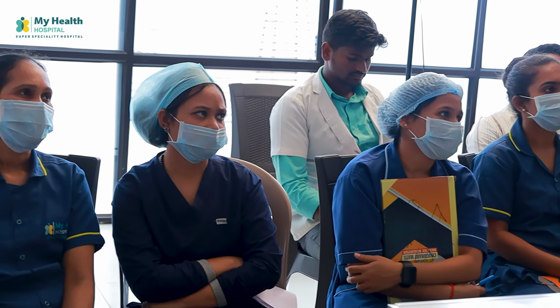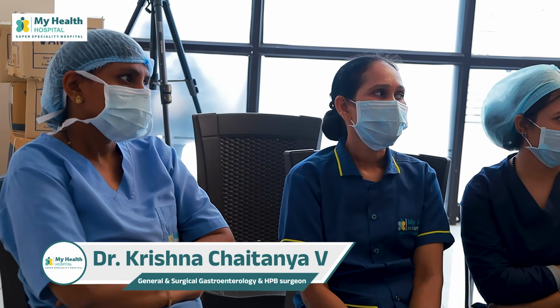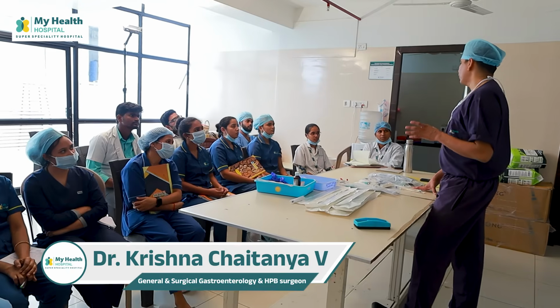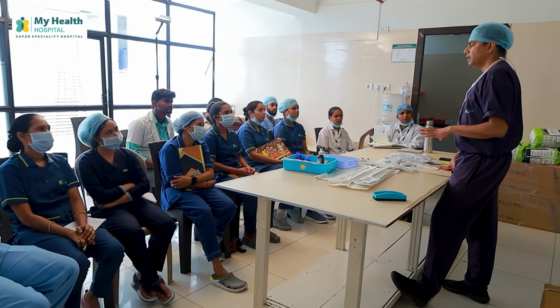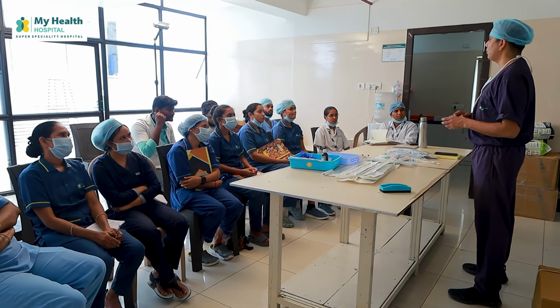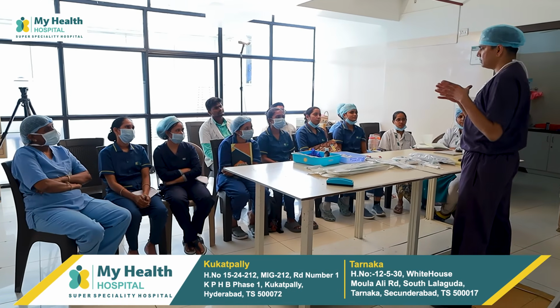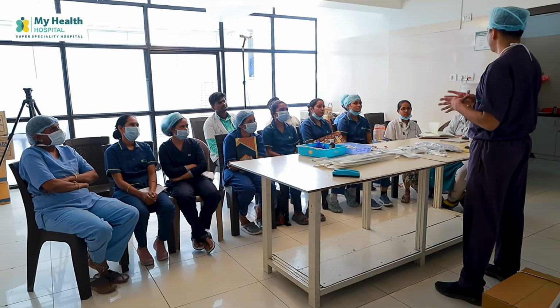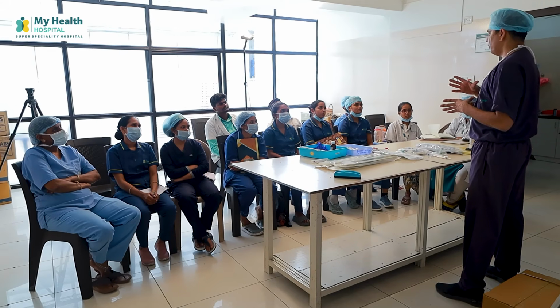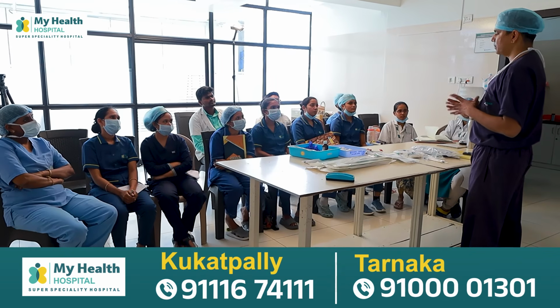What is the ideal time to aspirate after inserting a Ryle's tube, after feeding through the Ryle's tube? After 2 hours, you do a trial aspirate. How much? When do you continue with the feed, and when do you stop? Hold it before continuing the feeds. For example, if the patient has been fed with 100 ml of liquids, you wait for 2 hours and then you aspirate.